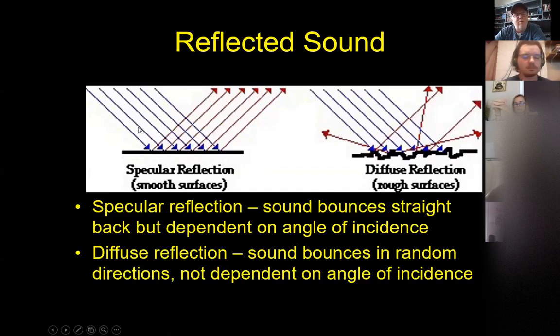Basically, the concept I want you to understand is this: let's say this black line here is the capsule of a kidney. We know from anatomy, or if you post a dog and open it up and look at the kidney, what does the capsule of the kidney look like in a normal dog? It has kind of a white sheen to it. It's very smooth and glistening, and it looks like this black line. So it's a smooth surface.